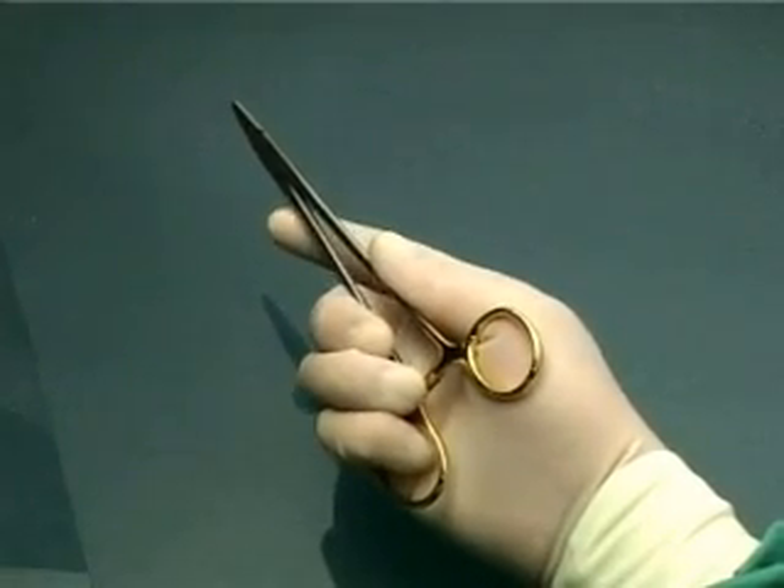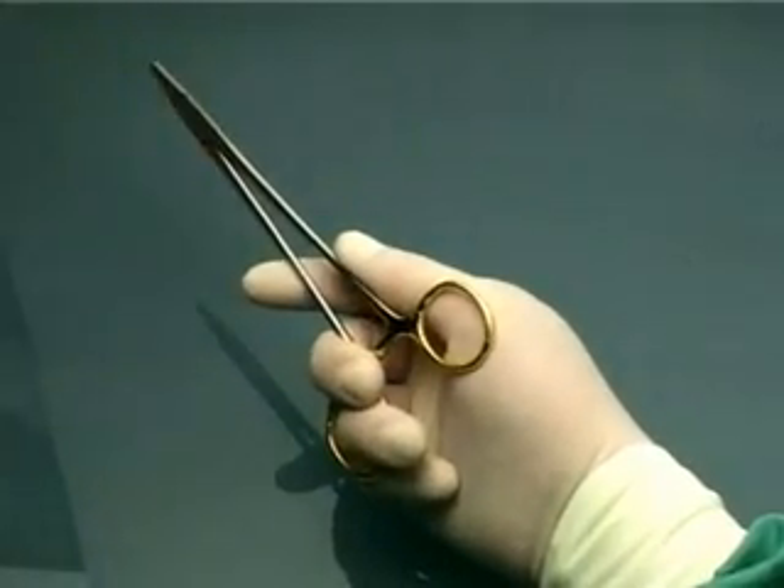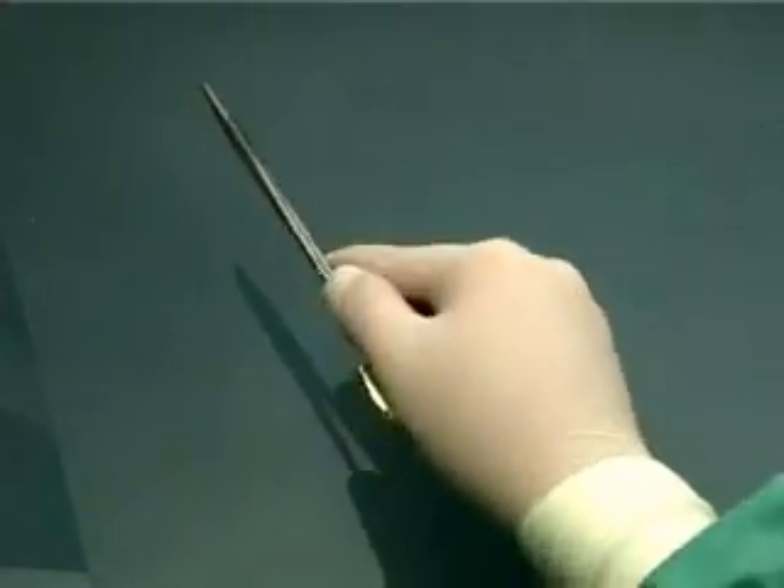A compromise is to hold it this way, with just your ring finger in the ring. Master one technique first before going on to the next.